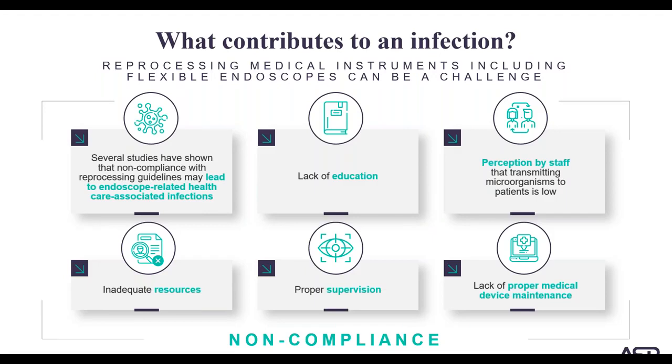A friend of mine tells a story of when she was a GI manager. She had a technician who was the fastest for manually cleaning flexible endoscopes. The staff loved it when she was on because they knew they would get their scopes back quickly. But the manager realized that, well, that wasn't necessarily a good thing. So one day she did go to observe the technician, and sure enough, she was missing some steps.